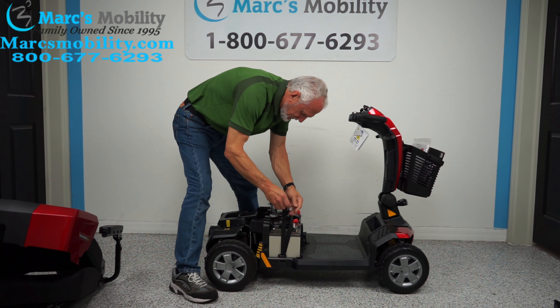Then take your seat — the seat's pretty heavy, so sometimes you might have to have two people for this, it's about 40 pounds. You want to put the male piece in here and then it's back on. Put your seat back up.